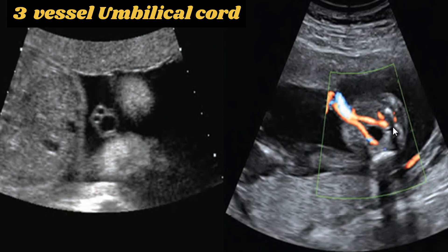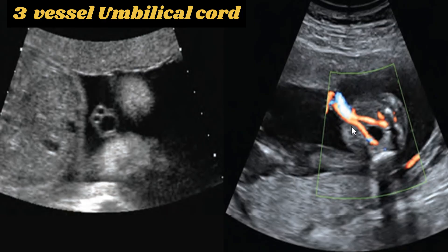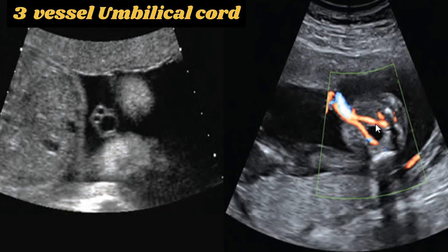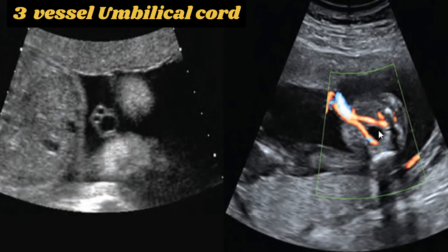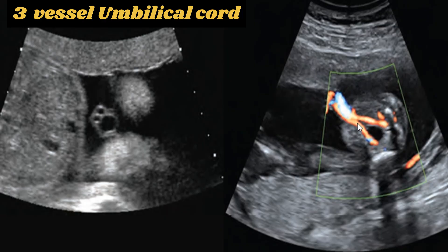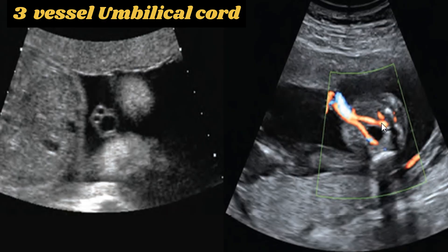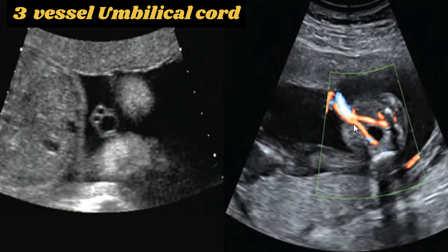In this sonogram, we can see the fetal pelvis with a color Doppler view at the level of the urinary bladder. The urinary bladder is visible, and it shows umbilical arteries along the lateral margins on both sides of the urinary bladder.